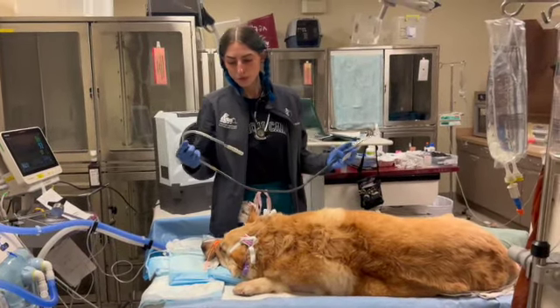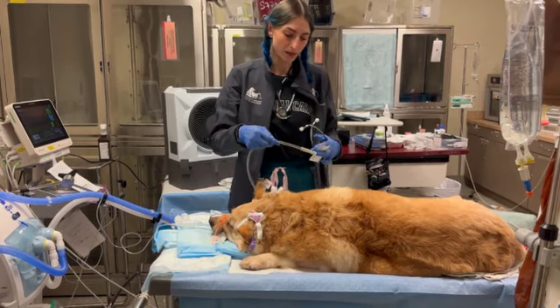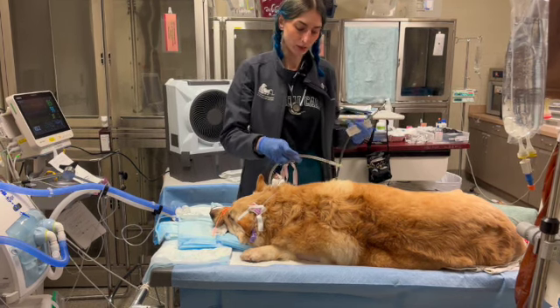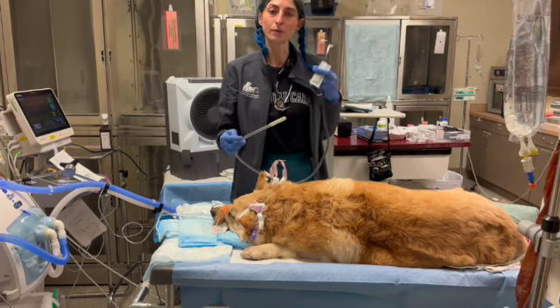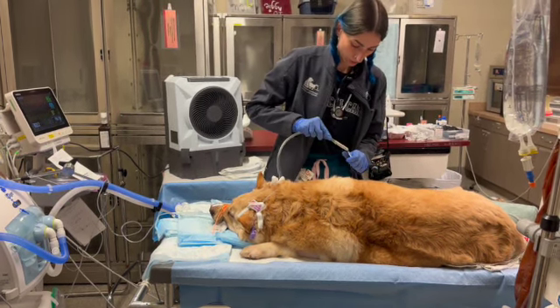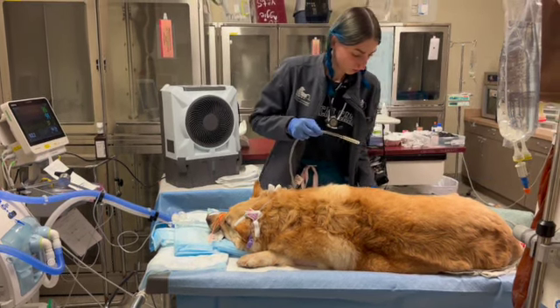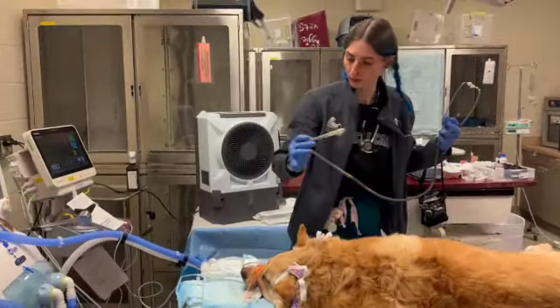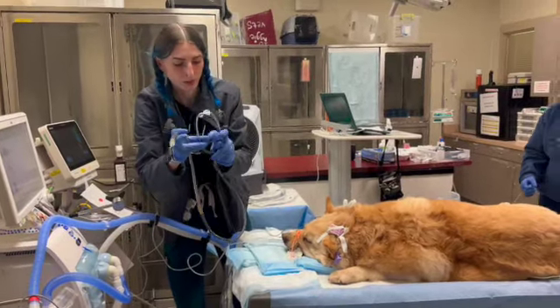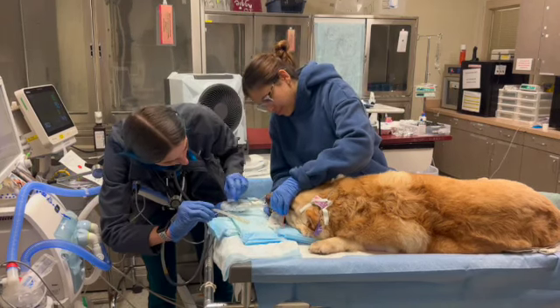For the esophageal stethoscope, we're only going to advance it to about the heart base, which is going to be about 28 to 32 centimeters. And then once we've hit our 28 to 32 centimeters, then I will go ahead and listen and see if we are in the appropriate spot. So I'm going to go ahead and just lubricate my esophageal stethoscope for my patient's comfort. We're just going to have someone gently open his mouth so it's much easier.